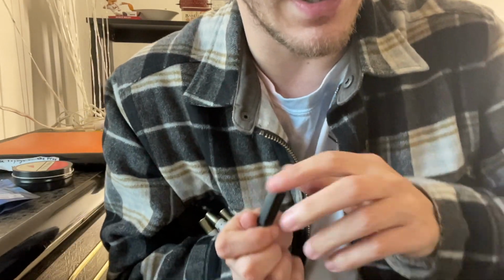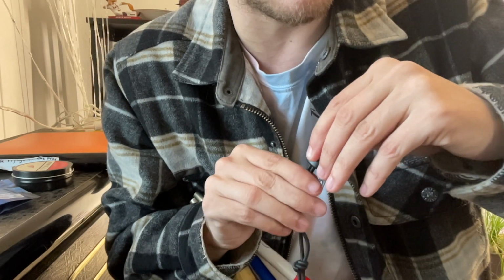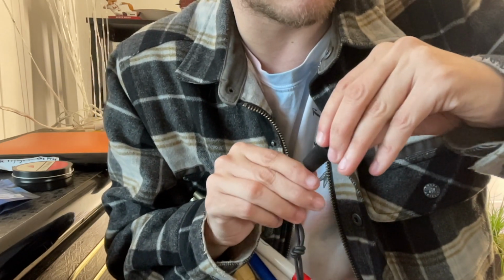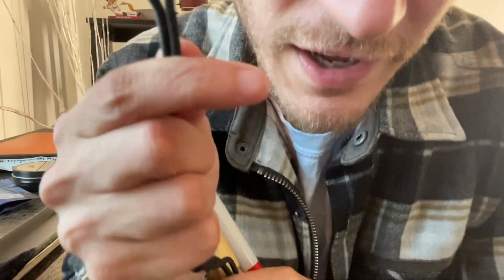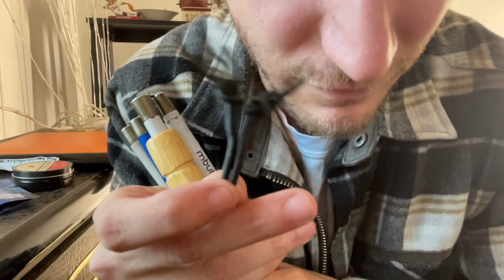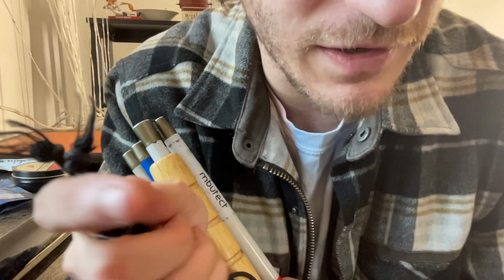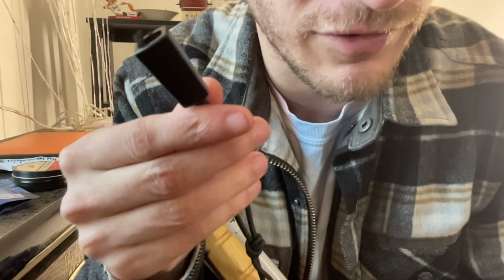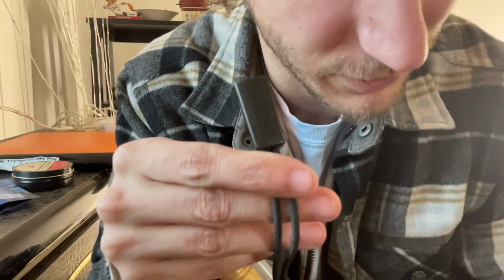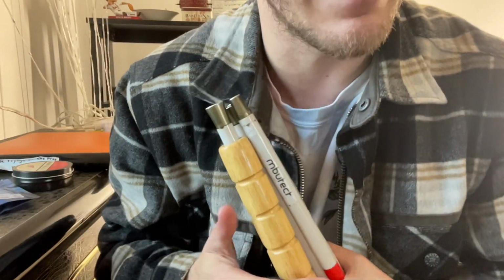But if I slide that plastic piece, you'll see that the cane is just tied off in two different bungee knots at the end. So I'll see if I can get those on camera for you. Little bunny ear antennas. But this plastic piece then holds onto them and largely helps to prevent fraying, which is really cool. So that is a pro on the bungee side of Utch.